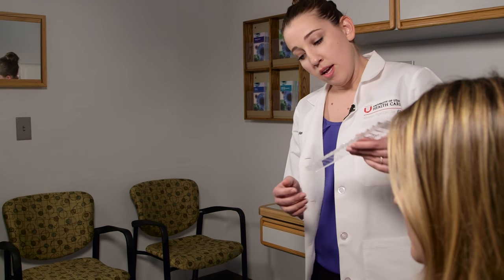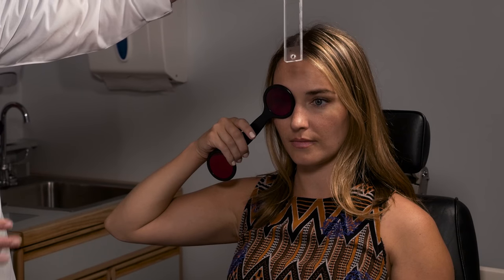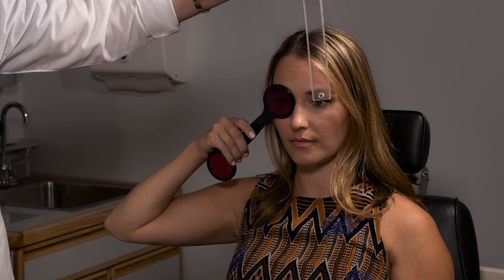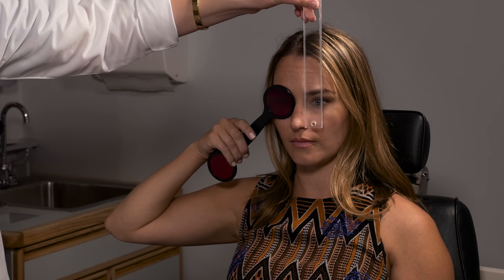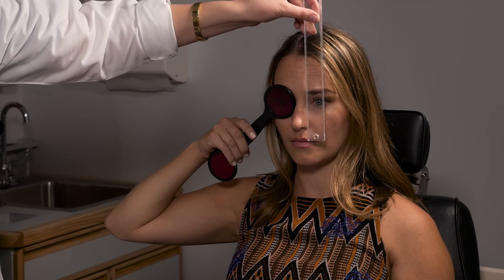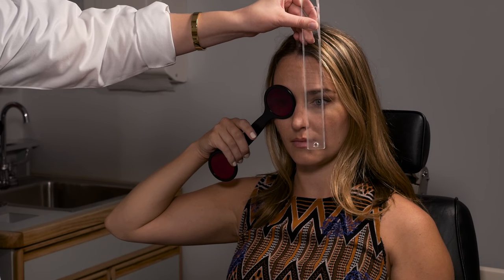I'm going to show you how to measure the deviation with the Maddox rod. She's very well aligned, but for argument's sake, let's pretend she had a vertical deviation — the white light is above the red line. You can use a vertical prism bar and add more prisms. Since the white light is above, I'm going to be correcting a left hypo deviation. You add increasing prism until the patient tells you the white light and the red line are perfectly aligned.